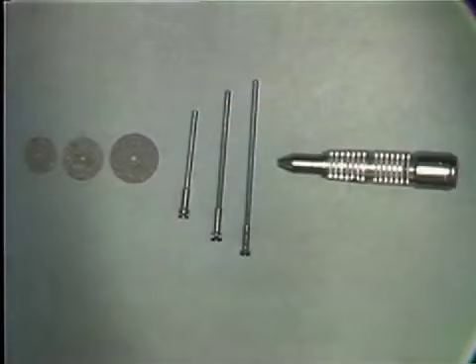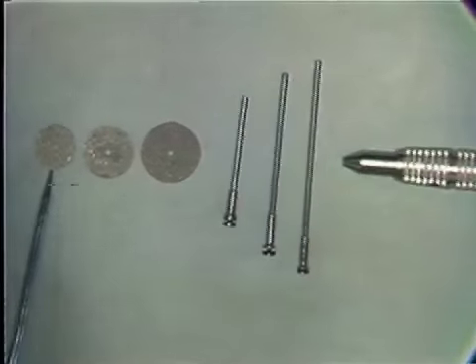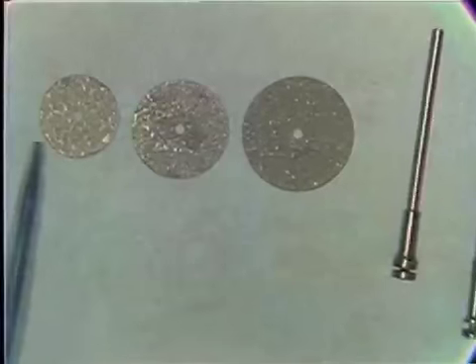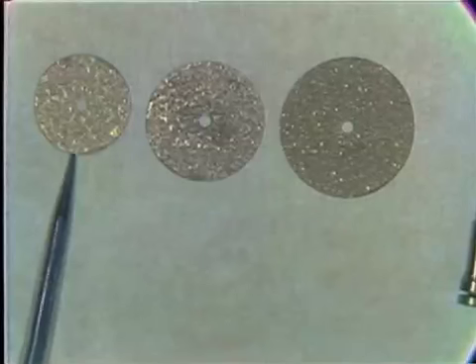The instrumentation for a slice preparation is carried out with lightning discs, mandrels, and the straight handpiece. Seldom do we use a contra-angle for slicing. The discs, as we can see here, come in different sizes. There is a 1/2 inch that we are not showing, and that is sometimes used, but 90% of the time a 5/8 inch disc is used for slicing the teeth.